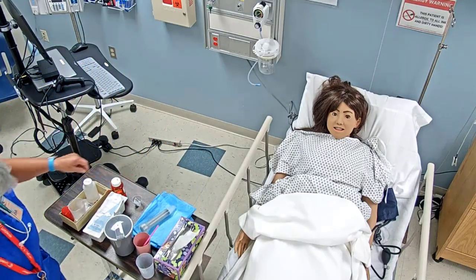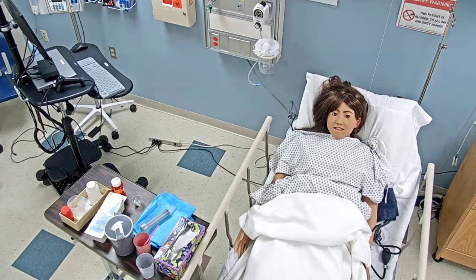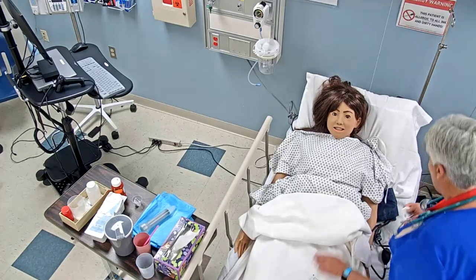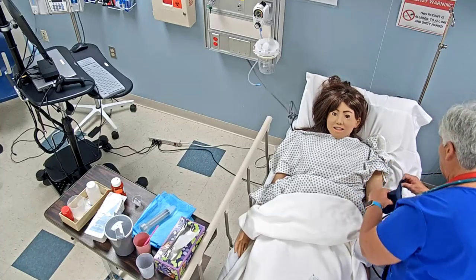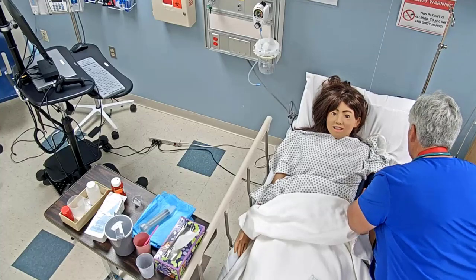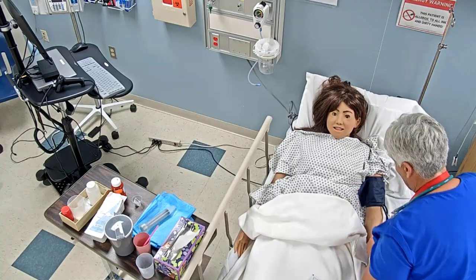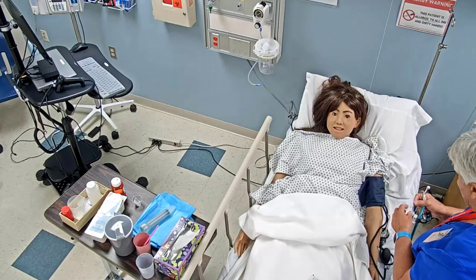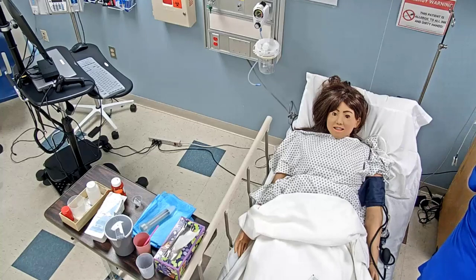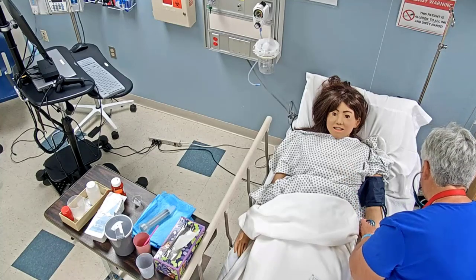I'm going to put some alcohol preps in here. Alright, I'm going to go ahead and get your blood pressure done. Do you know what your normal blood pressure runs? 120, something like that? Okay. So we want to make sure we're in the right parameters before we give this metoprolol. So let me go ahead and clean my stethoscope. And then we're also going to be listening to your apical pulse, and I'll do that after I get through with your blood pressure.